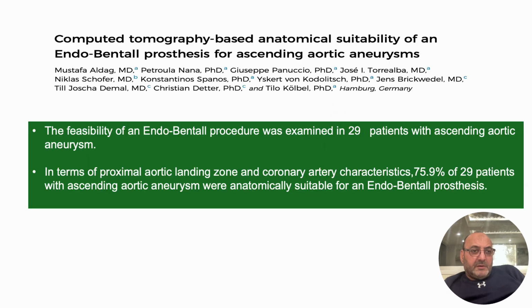Remember I talked about ascending aneurysm. This study out of Hamburg, Germany, looked into 29 patients with ascending aortic aneurysm and the feasibility of the endo-Bentall procedure. Surprisingly, they found that about 75.9%, essentially 76%, of the 29 patients had feasibility to undergo endo-Bentall.